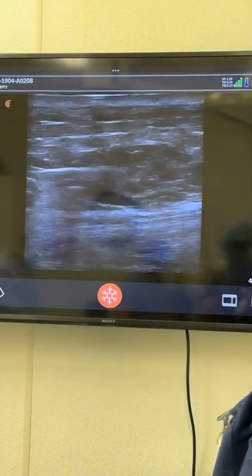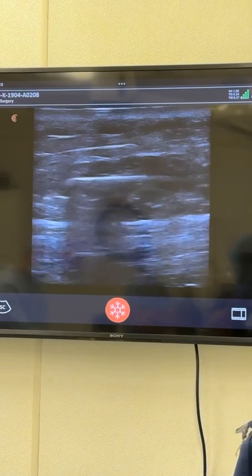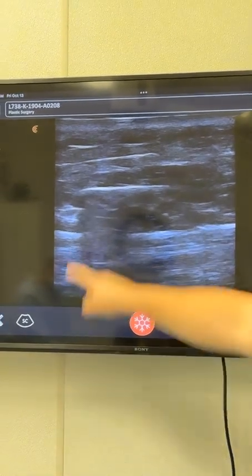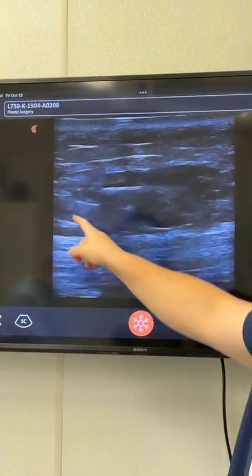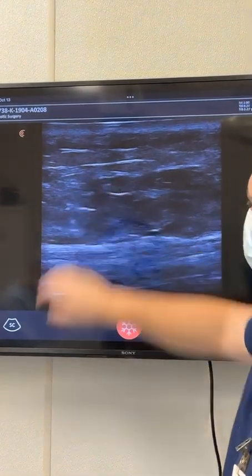Then I withdraw the cannula a little bit, and I'm going to give it a bolus so you can see. What we're going to notice is fat is going to enter the space. Can you see the tip of the cannula? That's the tip, right there. And now pay attention. There's gonna be a cloud of gray stuff. That's the fat going in. Point the tip again. 1, 2, 3, go. You can see the fat's already entering the space. The deep gluteal fascia is getting pushed down, and the superficial gluteal fascia is being pushed up as fat enters the space.